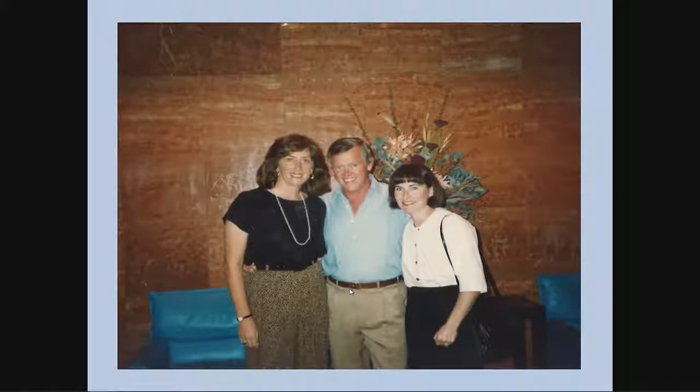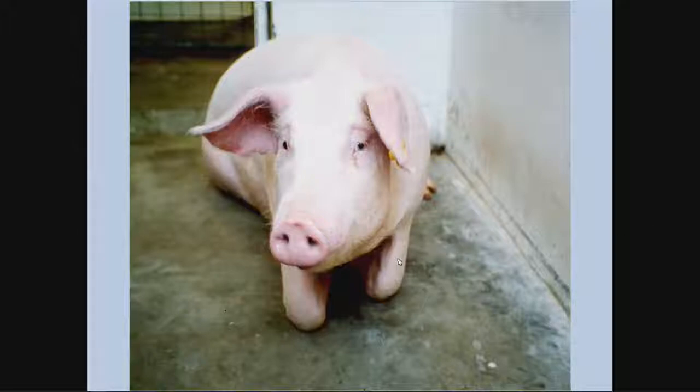Farnsworth, the urologist. This is a few years ago, as you can tell, and Di Layton was the radiologist who did the ultrasound on these pigs. Now, the problem was that we would get the pigs when they were little, and we would do a baseline scan to make sure they had normal kidneys.